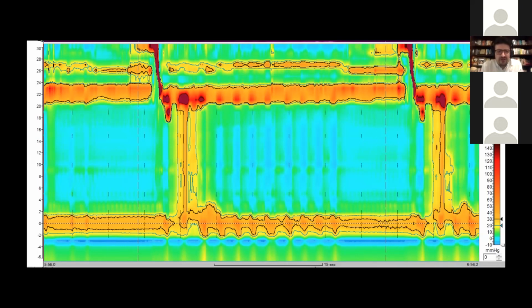So I guess you could call this pseudo achalasia, as it's not really an inherent problem of the nerve cells, but there is a distal obstruction. This Nissen is wrapped too tight, and it's causing these esophageal contractions.